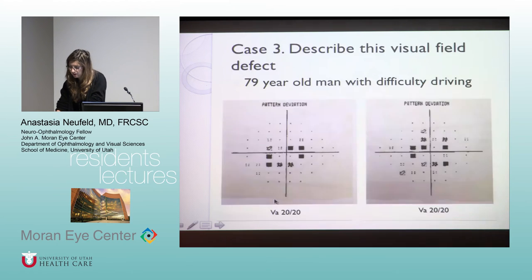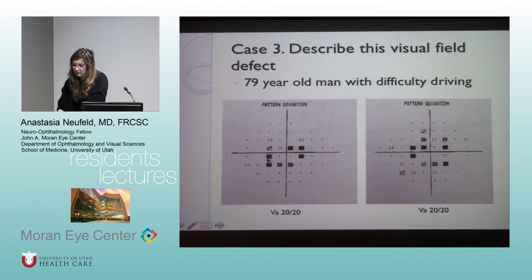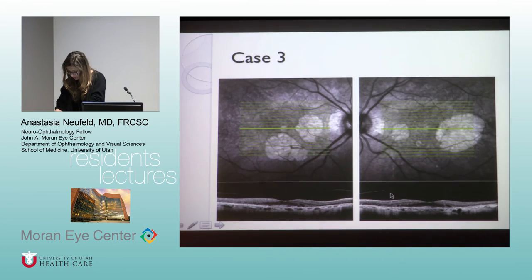And again, the other thing to point out is you can look at this physiological blind spot and see, well, is this a cecocentral scotoma? But as you can see, the visual acuity was quite good, and of course you have the corresponding pathology to see on fundus examination. They didn't do OCT? No, because they didn't see anything on the macula and thought the macula looked good. It looks really dramatic here, but in real life, okay.